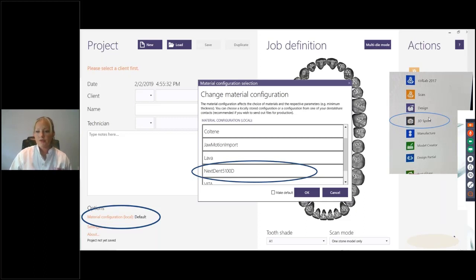So if you do have a 5100, you will have that button, as Lucas explained, and this will automatically put everything in there in the correct material. But I'm going to show you about some of the materials that are more popular that you would start with in your office, and then I'll go through how the printer works itself. So the first thing is you don't have to worry about settings, thankfully, finally. Up until now, you've always had to dial things in.